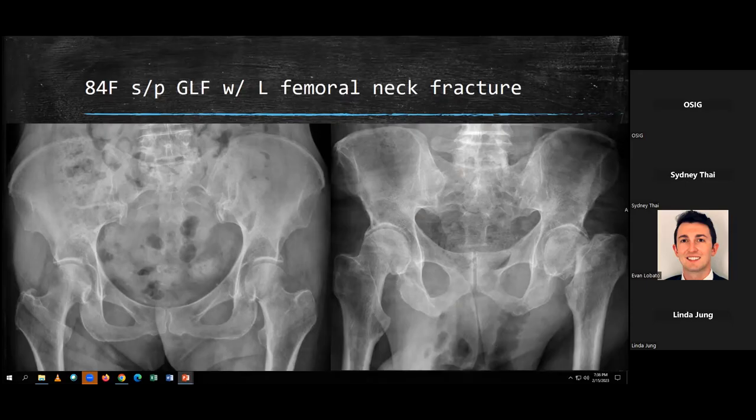All right, I see a lot of gaps here. Yeah, right, kind of where it would be the femoral neck. I put these up on purpose beside each other. This looks nothing like this. This one is the bad one, and the fracture is right around here, and I'll draw it out another. But how about this one?